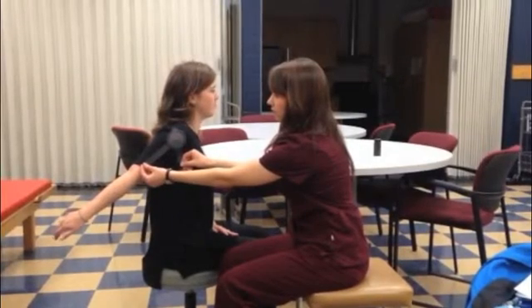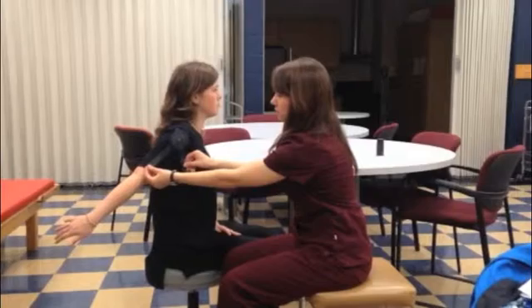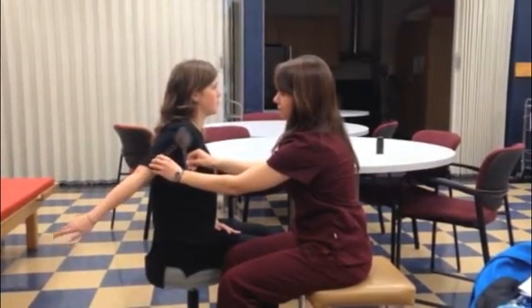At a complete range of motion, the therapist should notice a firm end-feel due to the ligaments of the shoulder being stretched. Rachel's full range of motion for shoulder extension is 60 degrees.